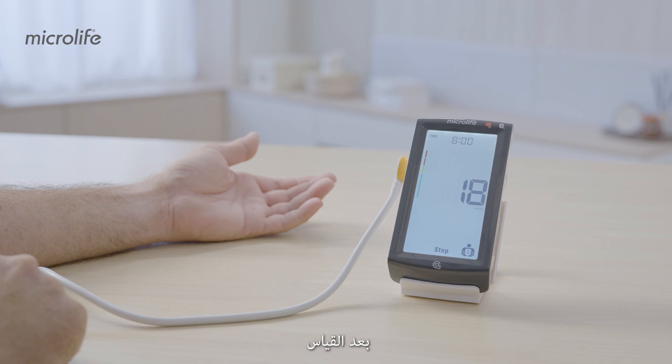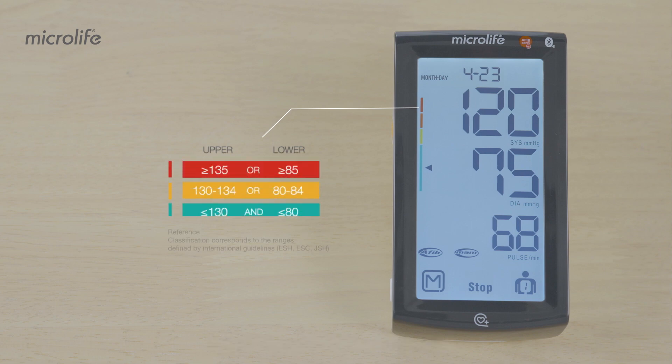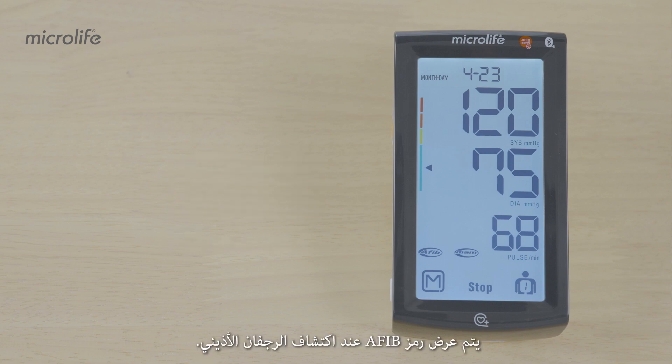After measurement, your upper and lower pressure values are displayed and classified based on clinical guidelines. The AFib symbol is displayed when atrial fibrillation is detected.